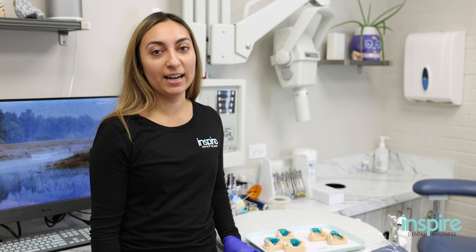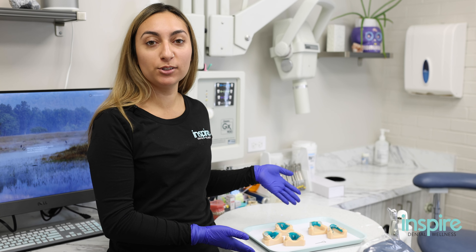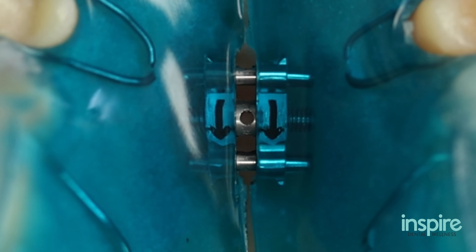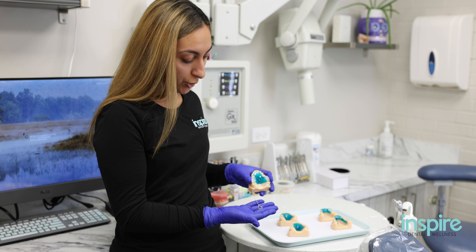Hi, I'm Jess. I'm the Ortho Assistant at IDW and I'm going to teach you how to turn your expanders. For our expanders, there are arrows and then there's going to be a hole. This is the key to turn your expander.